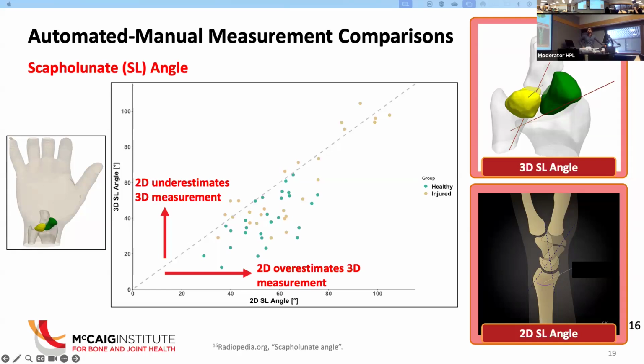Based on the work you've done so far in your cases, I'm assuming right now the gold standard is a non-load bearing, neutral position, 2D scan. So would you say, based on your work, that load bearing is an important aspect to add to those scans to understand what's going on with these?